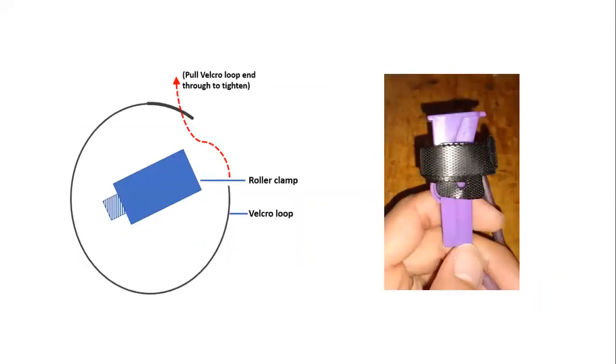Ultimately, brainstorming and weighing ideas against each other led to the purchase of Velcro zip ties. These ties could be very quickly looped around the roller clamps and fastened right above the wheel, where it tends to start budging to secure the wheel in place.